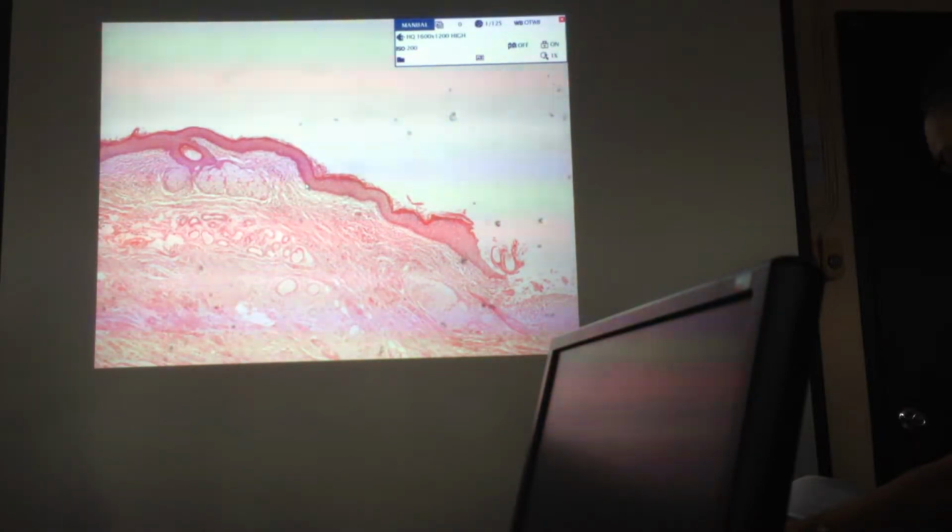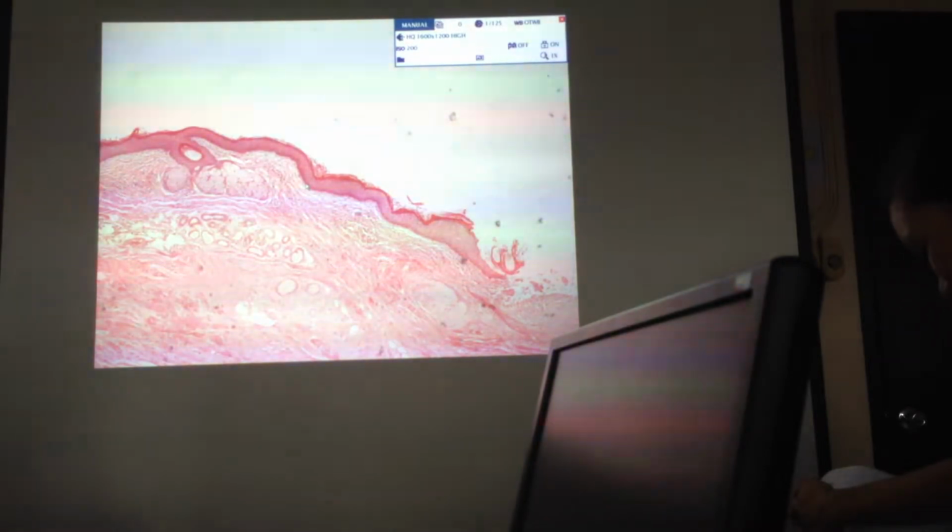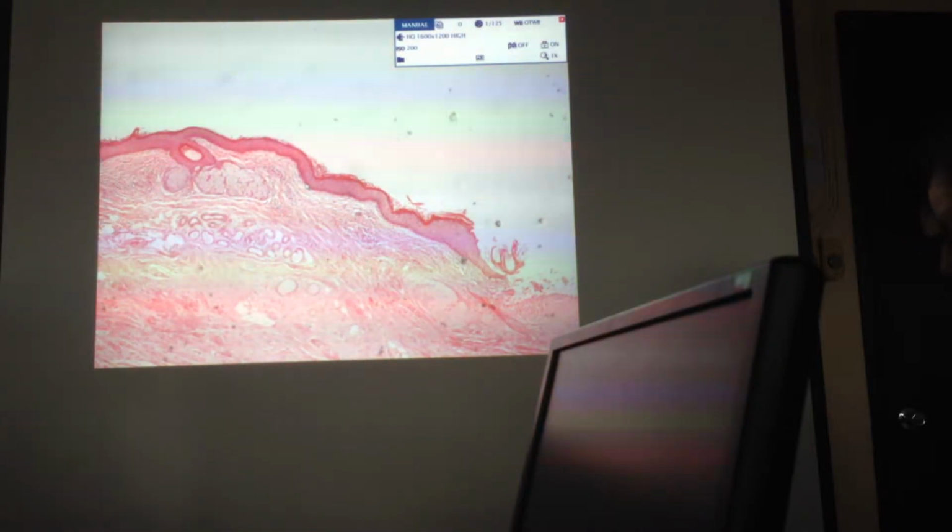When we look at the gross specimens for mature teratomas, we often would see the presence of a cyst that would contain sebum, okay, yung taba. Taba ba tawag doon? Coming from the sebaceous glands. And then we also have hair. Occasionally, you would appreciate the presence of tooth or teeth, yung mga ngipin. And then when we cut the lining or the wall, it's sometimes hard, which means that there's a presence of a cartilage or a bone. So, yun yung mga nakikita mo.